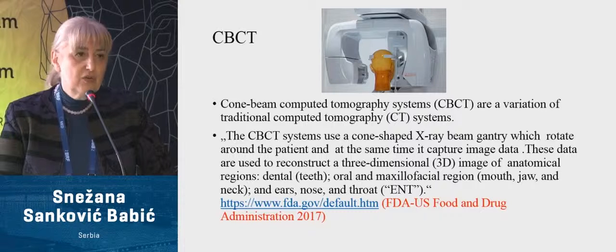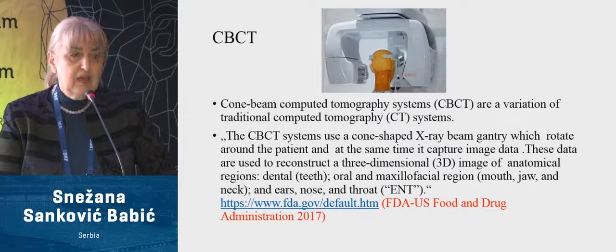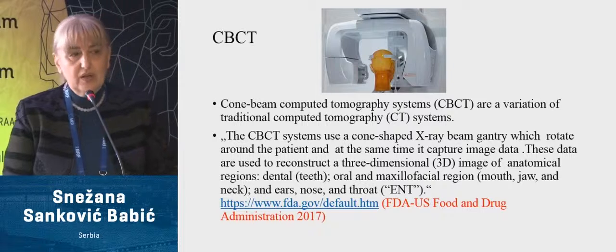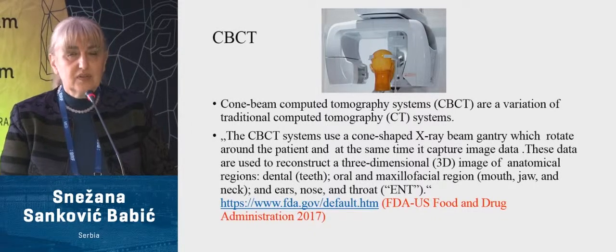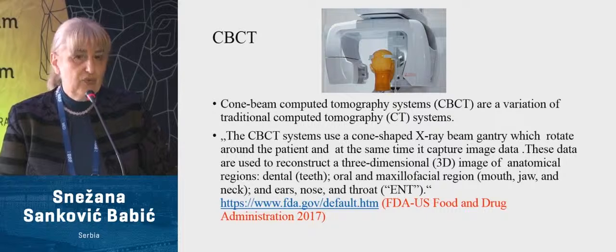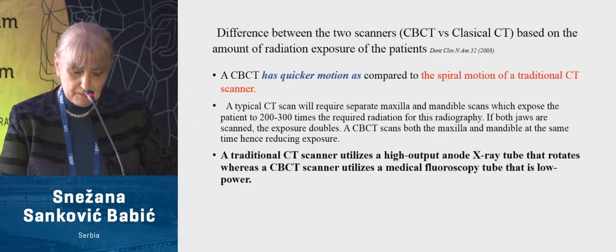Through sophisticated software it is processed, and 3D image data can be reconstructed if needed. Two decades ago, our colleagues from dentistry accepted this diagnostic tool, and oral and maxillofacial surgeons too, but in the last 10 years it was accepted as a useful tool in the diagnosis of ENT diseases.